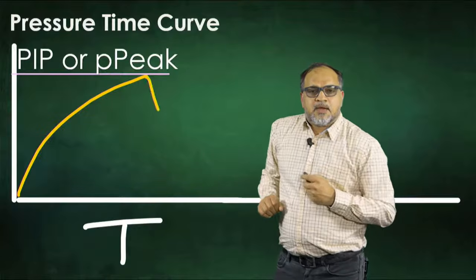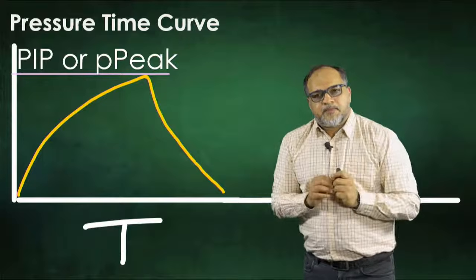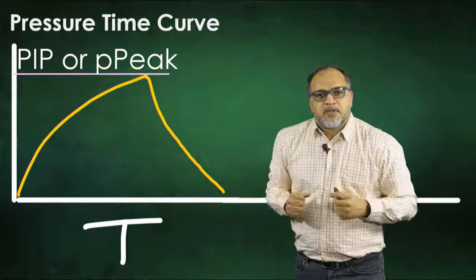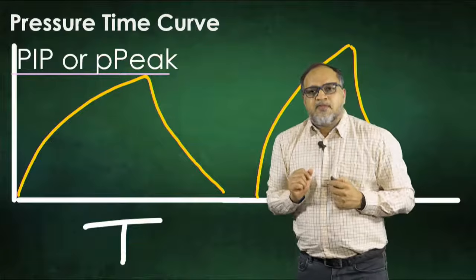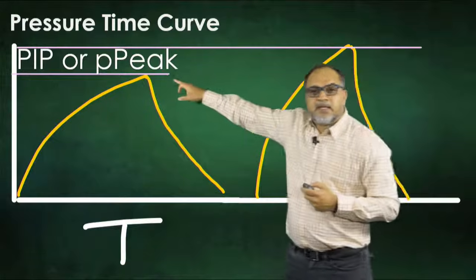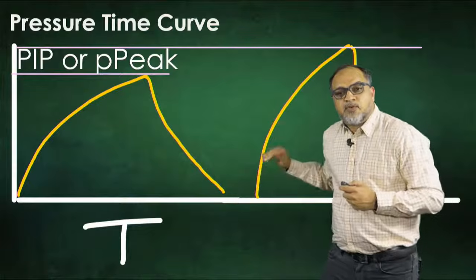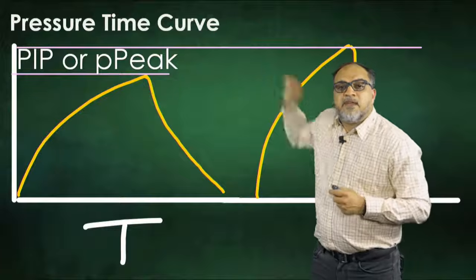Right. Now, let's say the same patient develops pulmonary edema. His lungs are filled with water. You gave him like 2-3 liters of water. Now, his lungs are stuffed with water. Now, if you want to give him the same 500 tidal volume, it will give the same 500 tidal volume, but this time the peak pressure, instead of being 30, it will go to maybe 45. So you are giving the same tidal volume, you are controlling the volume, but this time the pressure needed to generate that tidal volume is way higher.